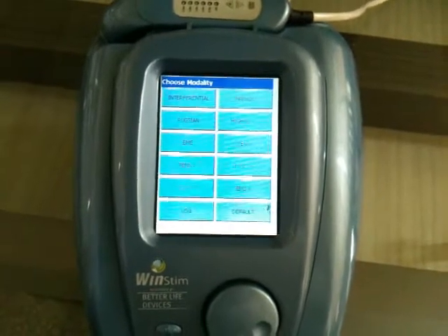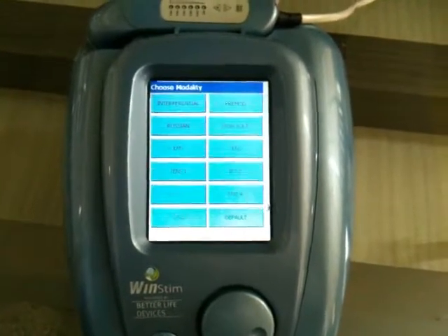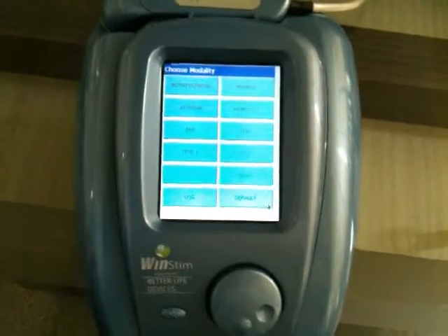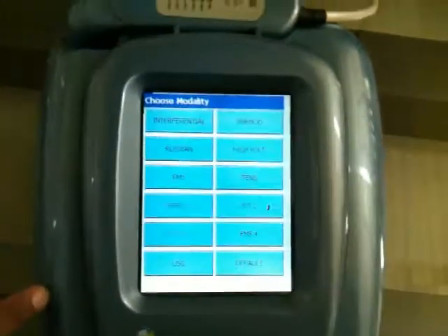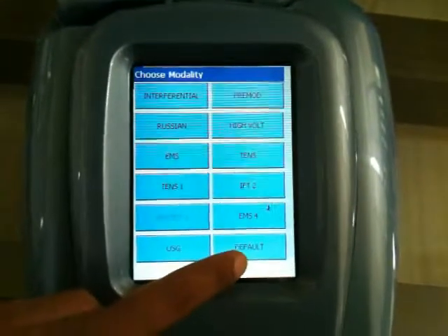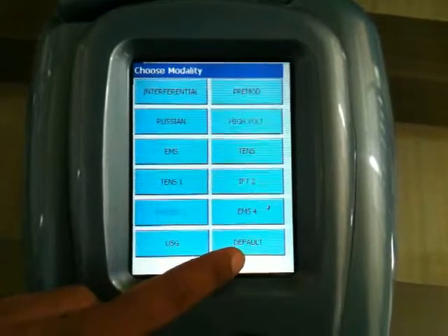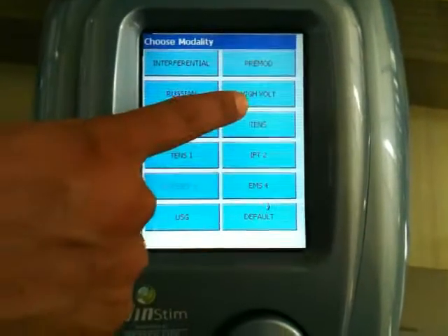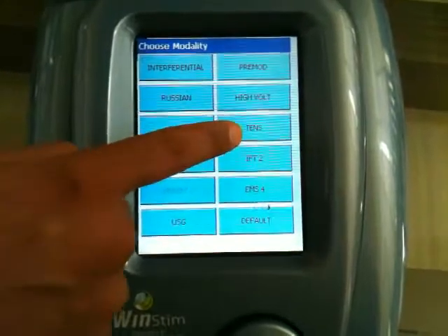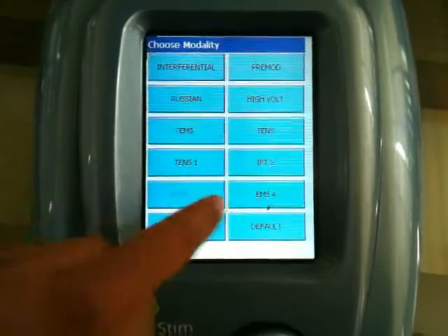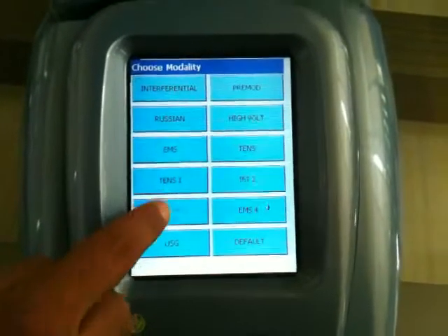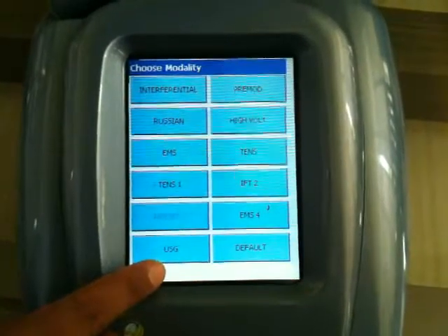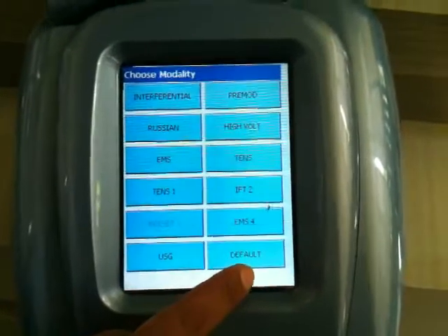This is the WinSTEM 4-channel with ultrasound combination therapy unit. In the choose modality part, we have interferential, pre-mode, Russian, high volt, EMS, TENS, and 4 additional presets to save a set parameter. Then ultrasound and the default mode.